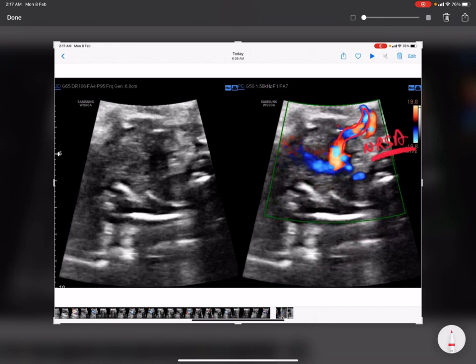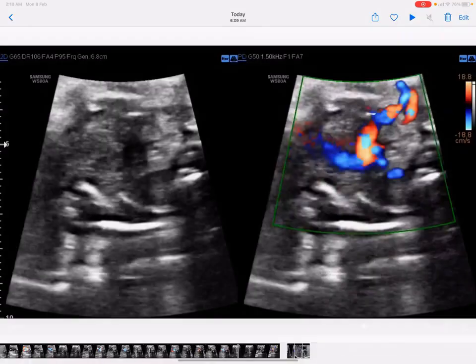Taking a curve, and this is the trachea over here. So this is anterior to the trachea, taking an S-shaped curve towards the right shoulder. Okay, here was the apex, so this was the left side, this is the right side, and this is how we differentiate it. So easy.